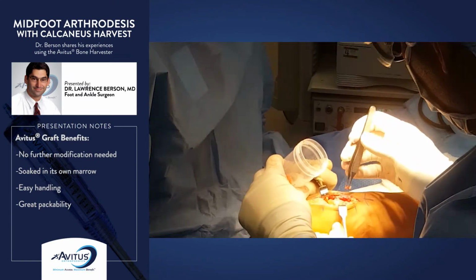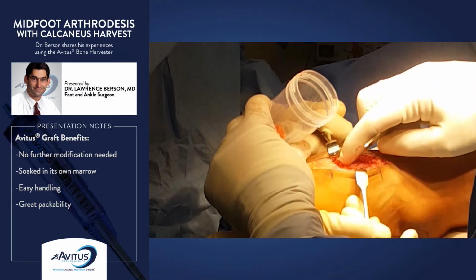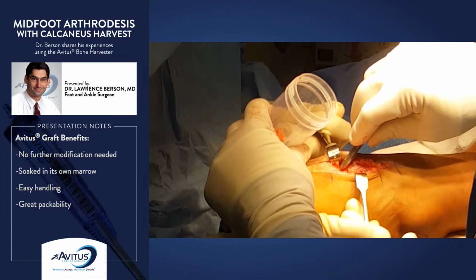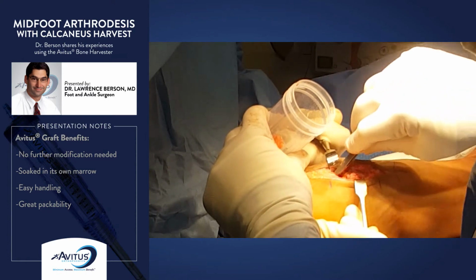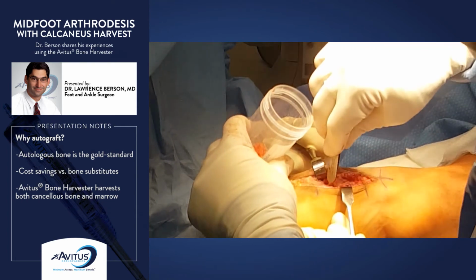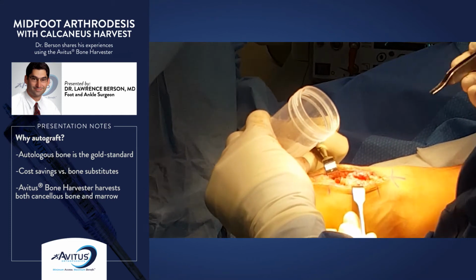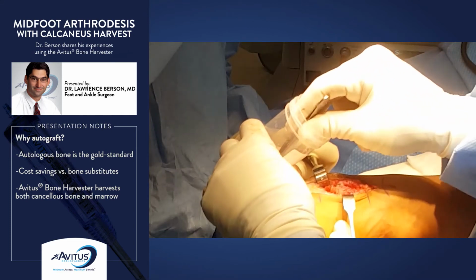So we did not have to modify this bone graft on the back table. The way it comes out with the curette is nice. It's already in small pieces. We also have it soaked in its own marrow because of the suction device, so it's pretty easy to handle. As far as options for your bone graft, you always have biologics, off-the-shelf products. I think autologous bone is still the gold standard.